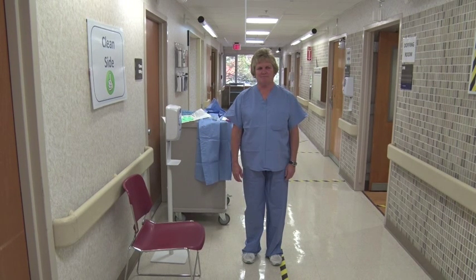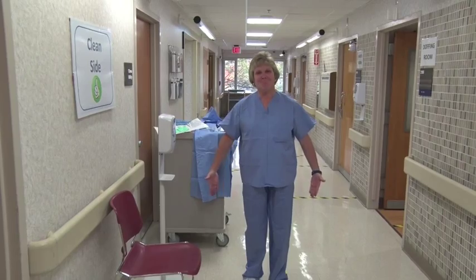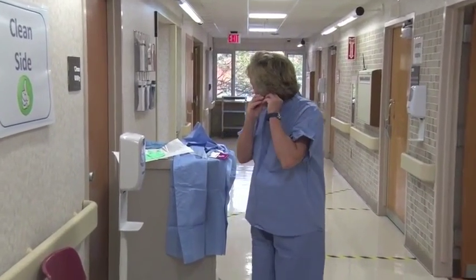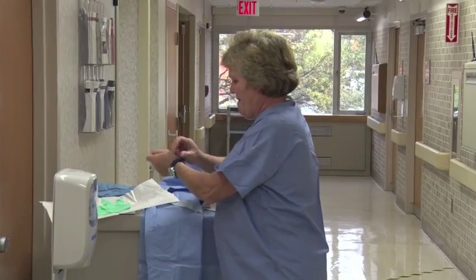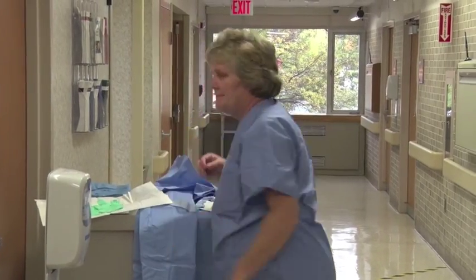This is the procedure for trained observer donning. First, change into hospital-issued scrubs. Remove jewelry and all personal items, including cell phones. If you have long hair, pull it back and secure hair off of the neck and back. Change into washable shoes.